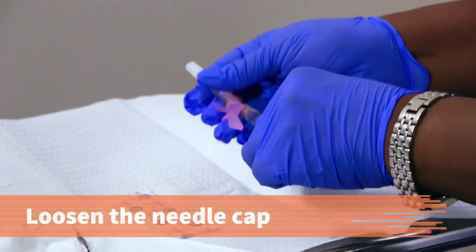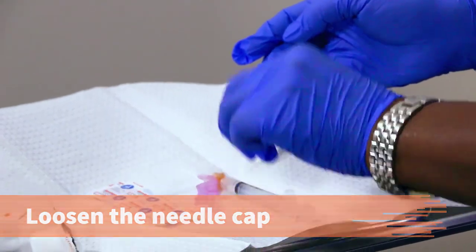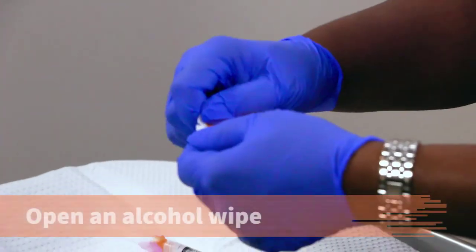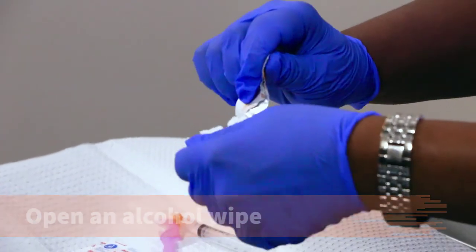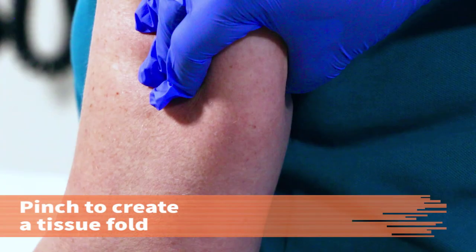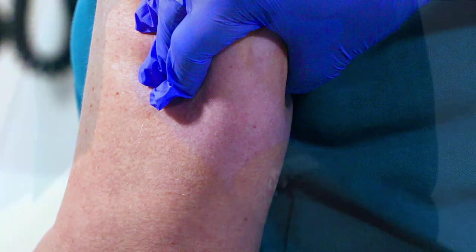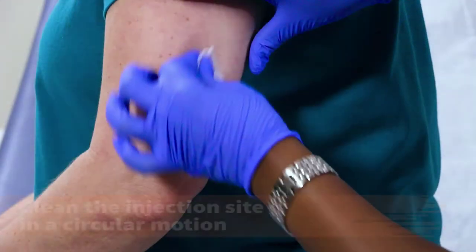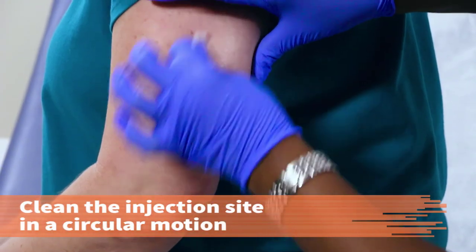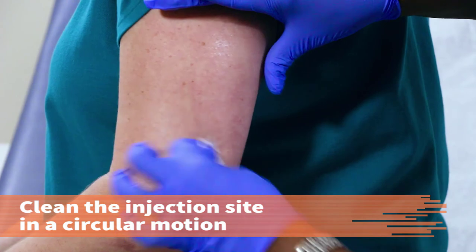Loosen the cap on the needle so that you'll be able to open it with one hand once you clean the injection site. Open the alcohol wipe. With the thumb and fingers of your non-dominant hand, grasp the tissue of the patient's posterior upper arm, pinching up the area to create a tissue fold. Cleanse the patient's skin with the alcohol wipe using a circular motion and moving outward from the center.